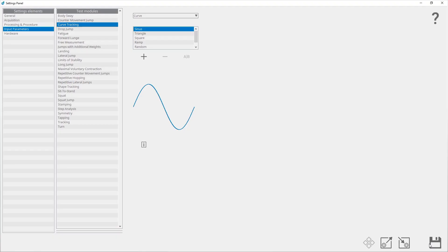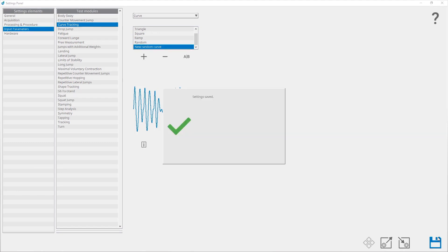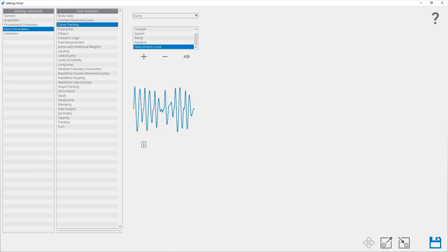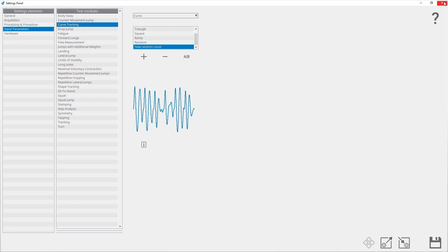To finish creating a new curve, click the confirm button. You can see the newly created random curve in the list. At the end, you have to save changes by clicking the save button. By clicking the detail button, you can see all the parameters of the newly created curve. The curve can also be deleted or renamed.